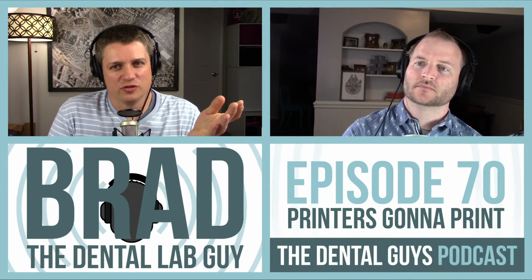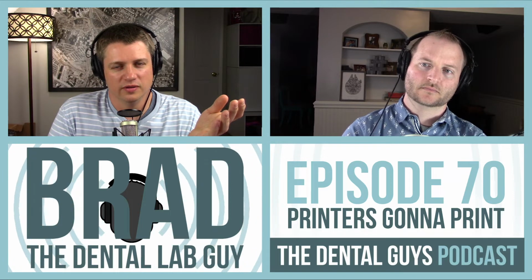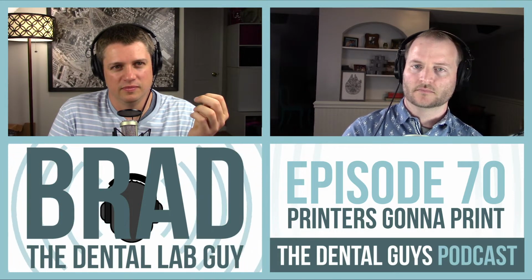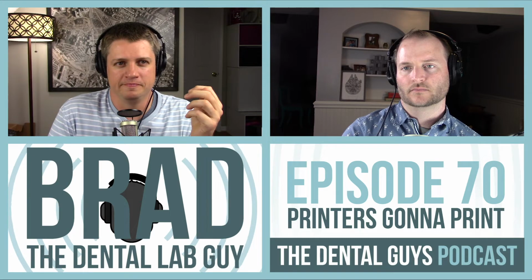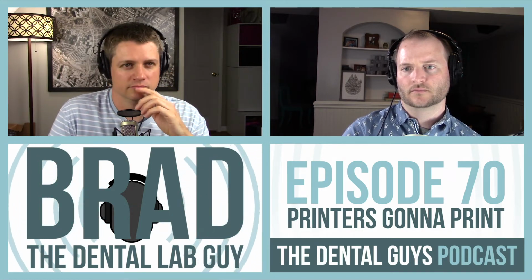So is that why labs have gone modelless, because it's just too hard to print a model to make it work? I think they're driving that because of that. There's a lot of technology that doesn't work accurately, and so, really, why do you need a model? You don't. If you have your CAD settings down, you can actually go modelless. Now, in our lab, I decided not to, but I have an accurate printer.